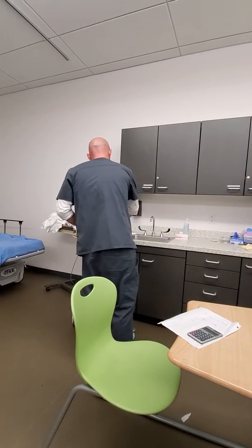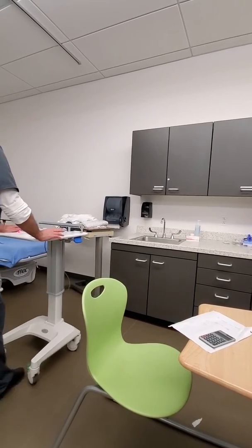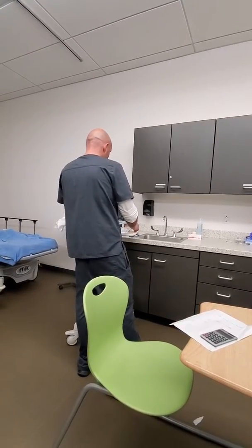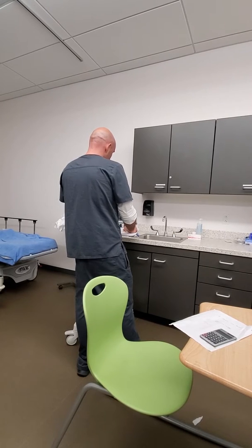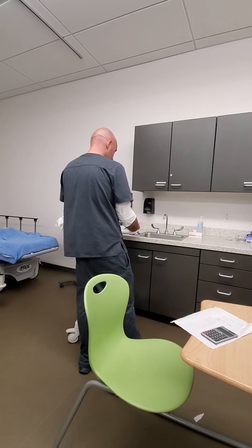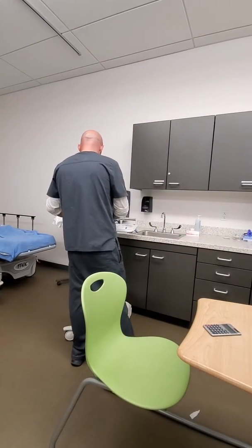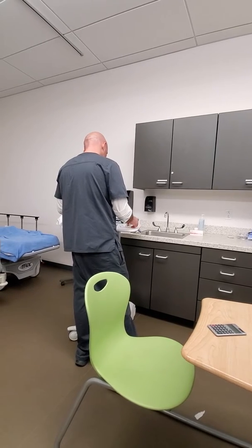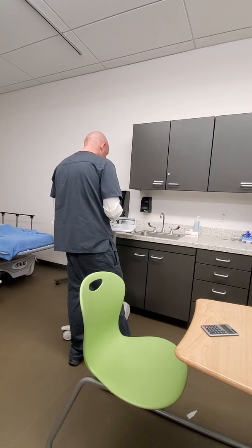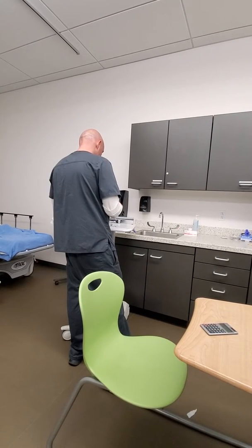Okay. So now that I have my supplies, I'm in the med room. I didn't leave yet, and I'm going to check on the MAR. It was Ancef, an antibiotic. I have Ancef here, and I brought that with me. It was 1 gram in 100 milliliters. I have 100 milliliters here, and I'm going to check that the medication is clear. I'm going to check the expiration date, which is November 2019.